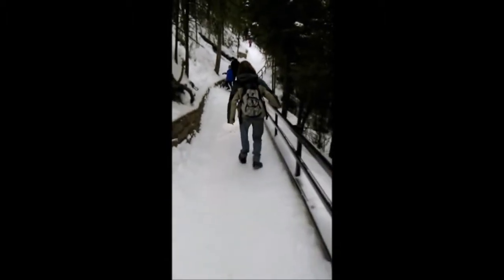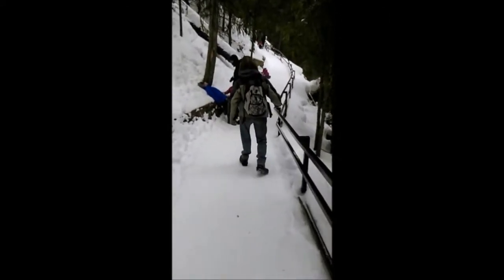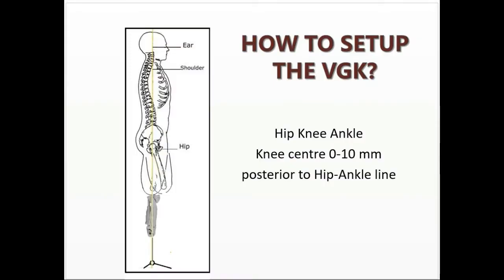Now in this video, you're going to watch a gentleman walking on something that scares even people with two good legs, an icy, snowy path. As you watch him, watch his hand on the right side. He's not too sure that this knee is going to be there for him when he's going down this path. So he's riding his hand just above the rail just in case he loses his footing. And as he goes, he moves his hand away from the railing because he feels in control. He knows the knee is for him. So we're going at different angles to flat. He's going between stance and swing as he does this path.